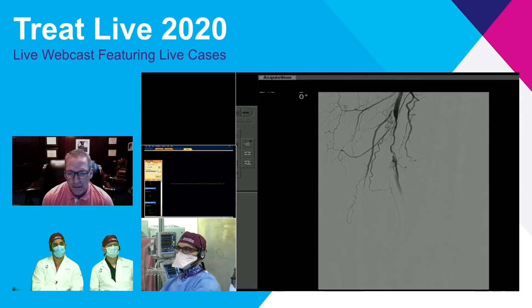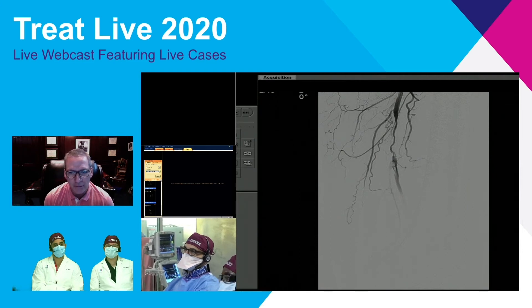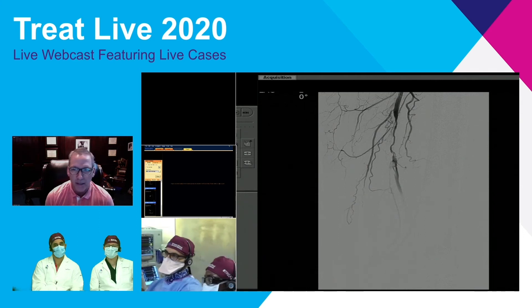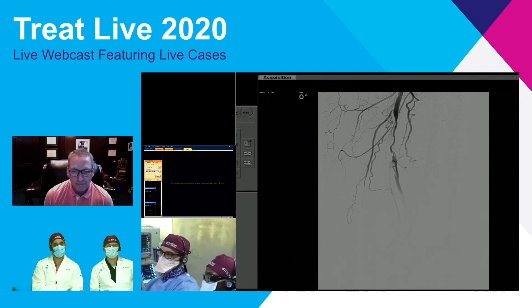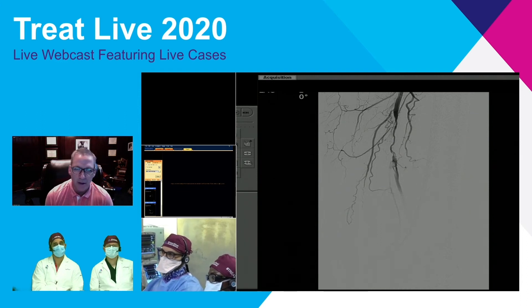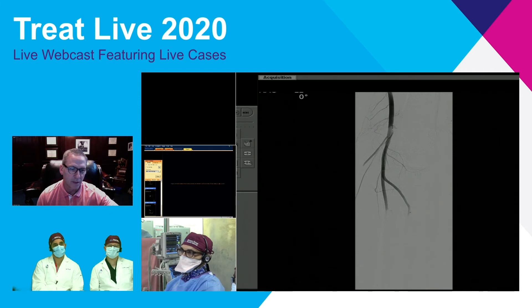If you had IVUS to evaluate whether or not there's any significant degree of calcium, then CSI is a reasonable option. If it's soft plaque, I would probably proceed just with angioplasty and provisional stenting if there are suboptimal results. But for a short lesion like this, angioplasty with provisional stenting would be my pathway.